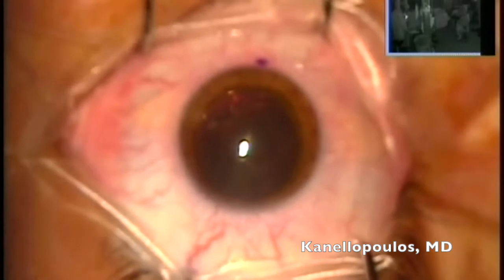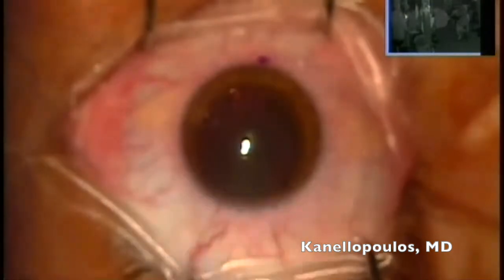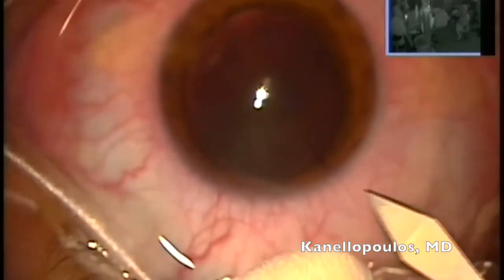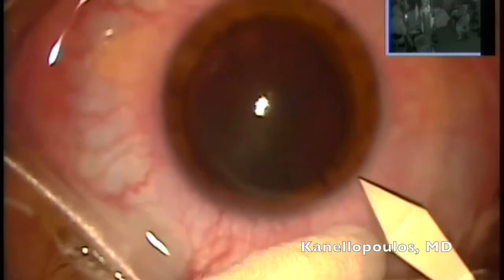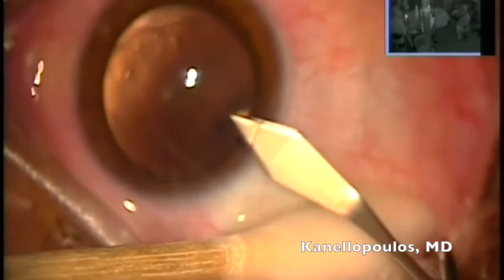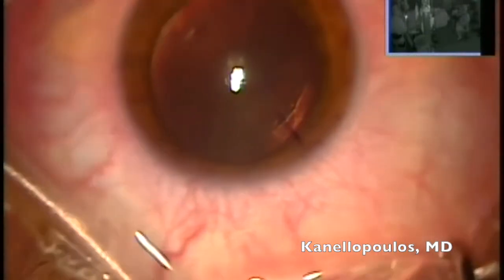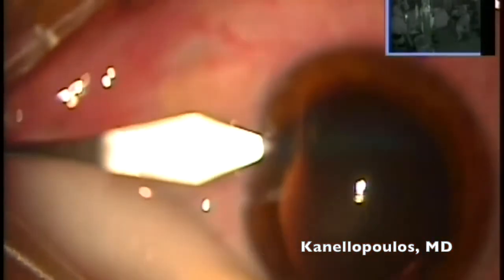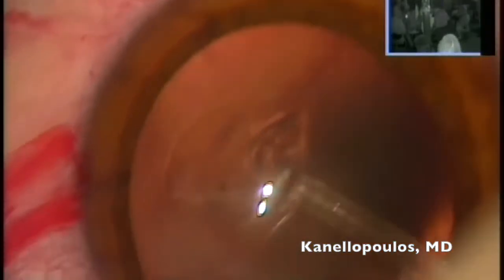We're going to adjust our Acrysof axis marker to 132 degrees — we've found this to be relatively accurate. I marked the 6 o'clock position on the slit lamp and used it as a reference for the second rotation. The patient is under peribulbar anesthesia. These are 132 degrees for a T9 lens. My incision is always around 135 degrees, and this is part of my IOL calculation for toric lenses. We're going in with a three-directional incision at 2.75mm keratome, with a paracentesis for the right eye at the 3 o'clock position. I'm going to use the same blade but just go in one millimeter.